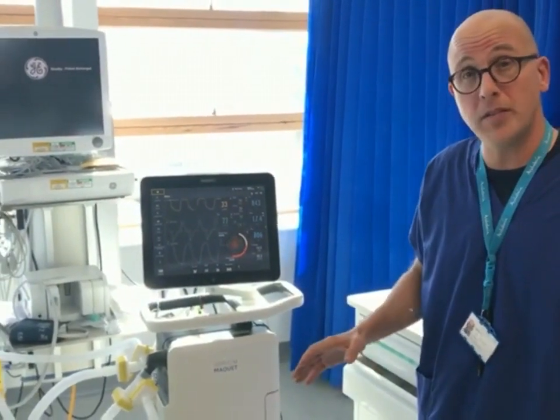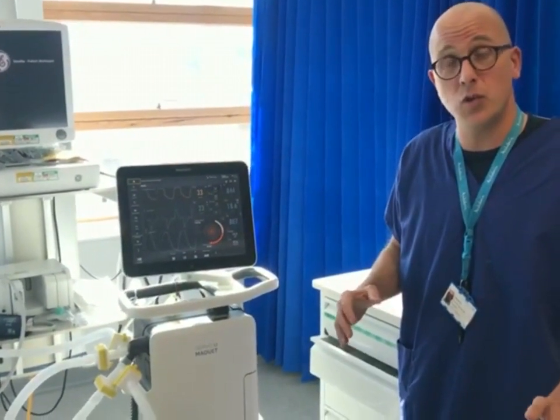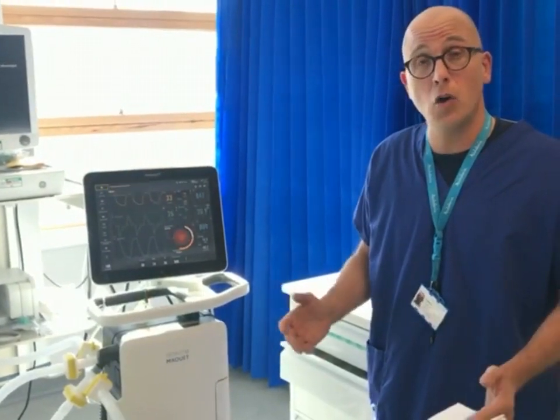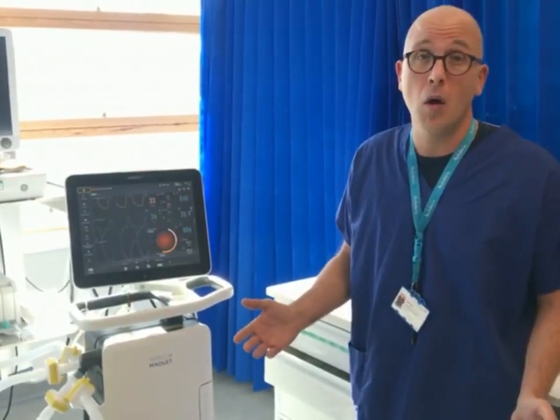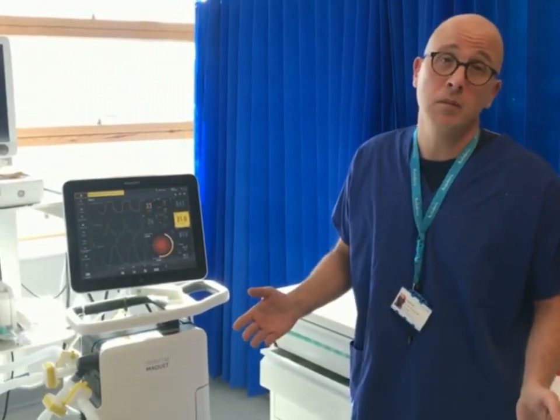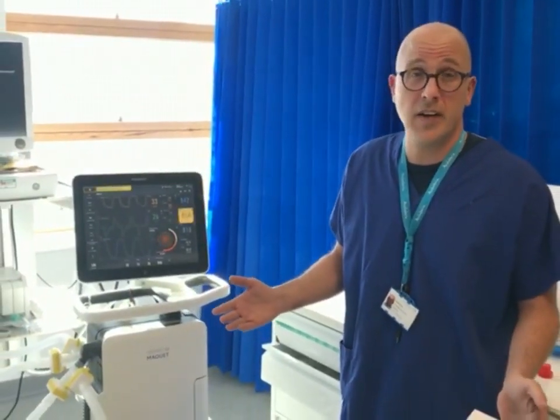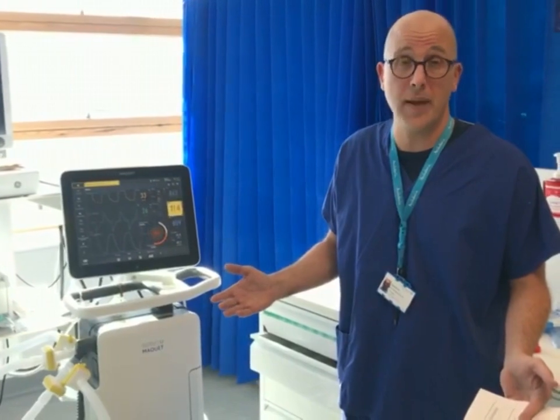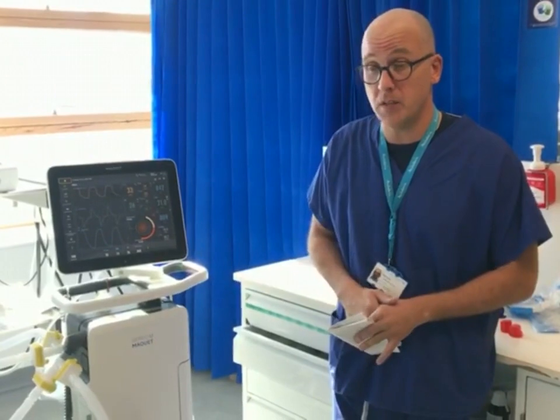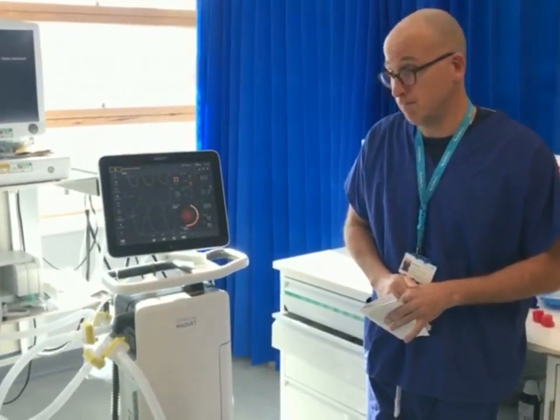Ideally it will be for 2 patients with the same pathology, very similar, and obviously in a situation where we are desperate, we don't have ventilators, or there is a multiple catastrophe, or we run out of options, as our last option. As far as I know, there are no trials on this system, and it has not been tried before on patients. The idea is to present this option just in case you need to use it in the near future. Thank you very much.